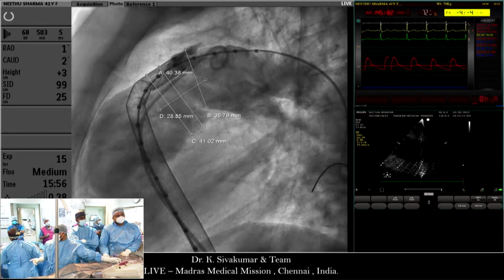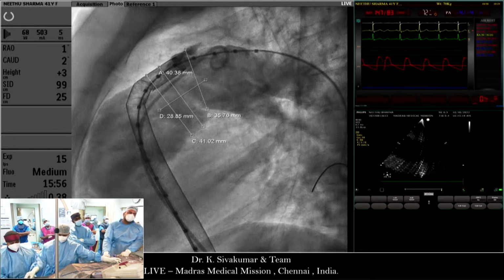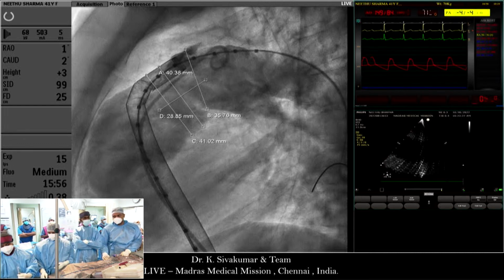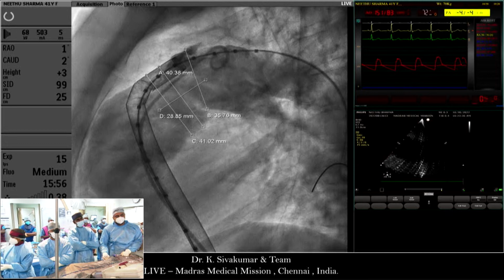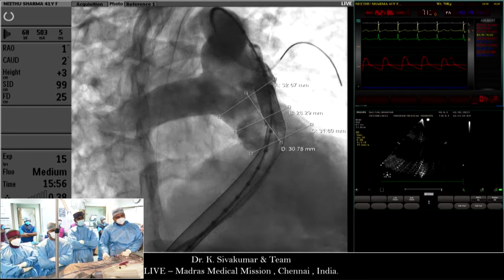Show the lateral. So in lateral, the distal main pulmonary artery is 36. The mid MPA is 40. And the proximal RVOT is 41. It is likely that the thick sheath and the thick wire are tenting the outflow tract superiorly, so that the LAO projections are smaller and the lateral projections are larger. It's anteroposteriorly elongated. Show the RAO dimensions as well.